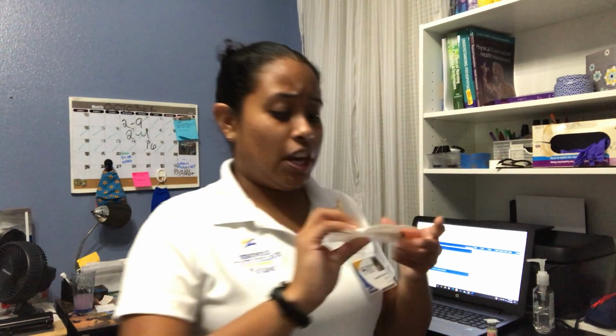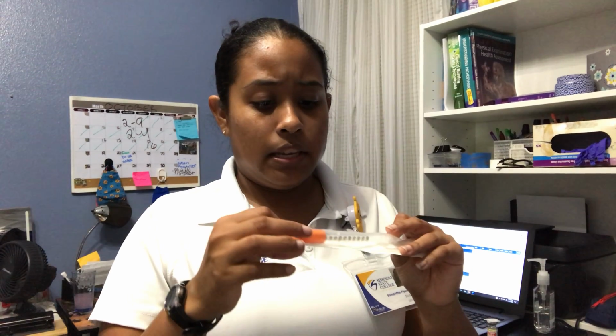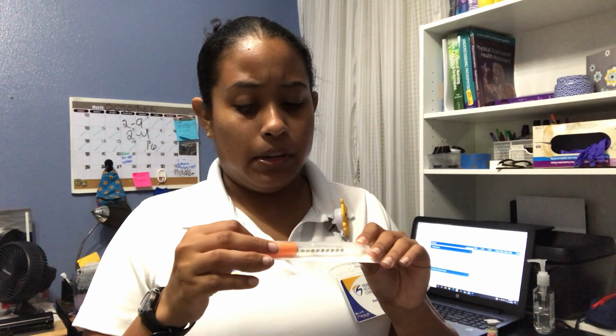Next, I check the integrity of the packaging of the syringe. It is not damaged. It is necessary for the medication.